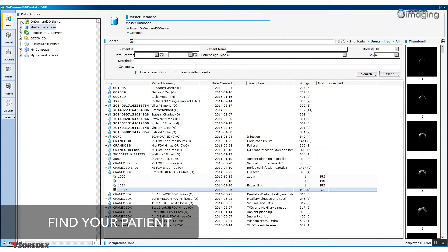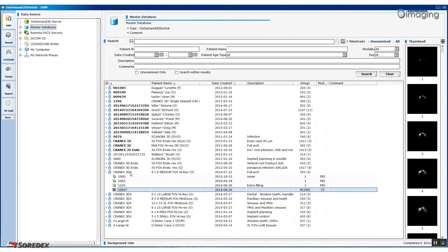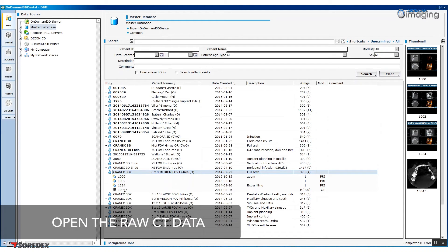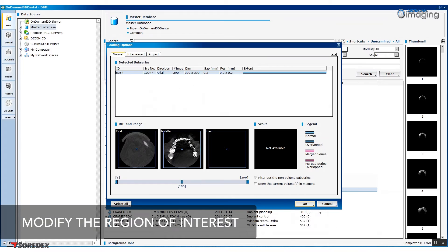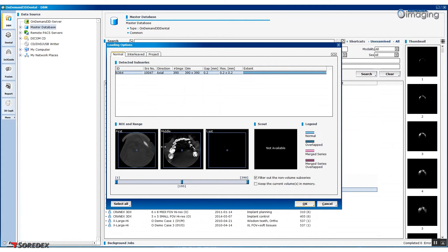In the left-hand column, select DBM, Master Database, and then click on your patient in the main window list. Find the DICOM file that you wish to use and click OK. After opening the file, there is an option to adjust and modify the region of interest by cropping the image or modifying the axial plane. Once you are happy with the image position, click OK.